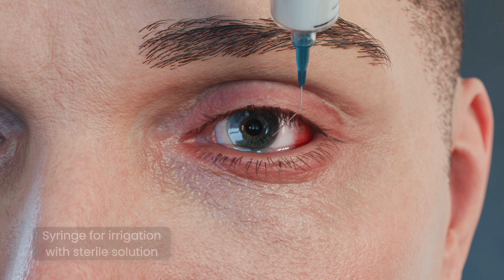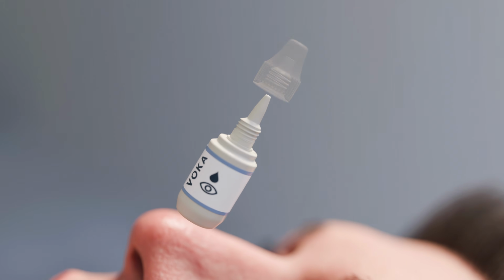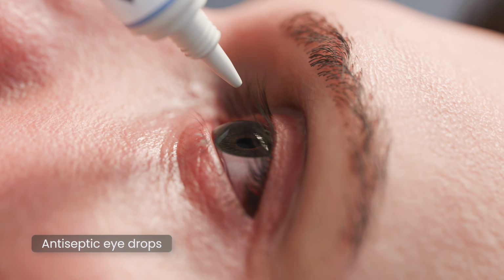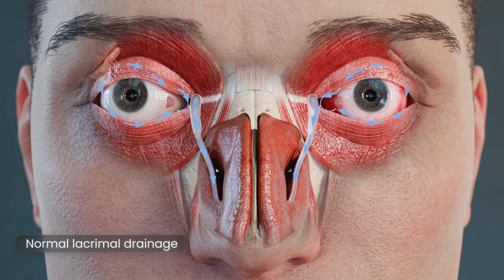Next, a Bowman probe is introduced through the lower punctum. The probe is first advanced horizontally along the canaliculus, then rotated vertically toward the nose and guided downward through the nasolacrimal duct into the nasal cavity. A give-way sensation indicates that the lumen of the nasolacrimal duct has been successfully entered.